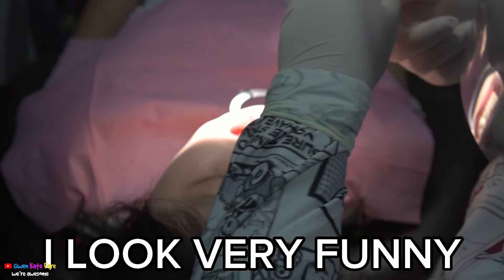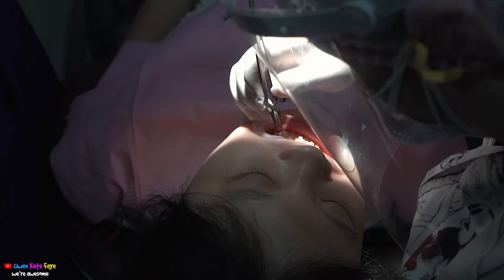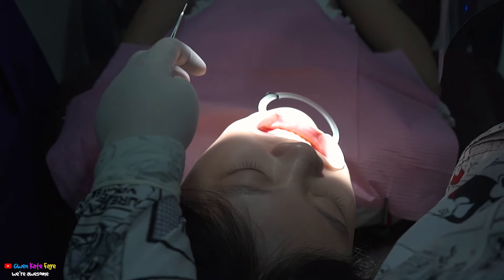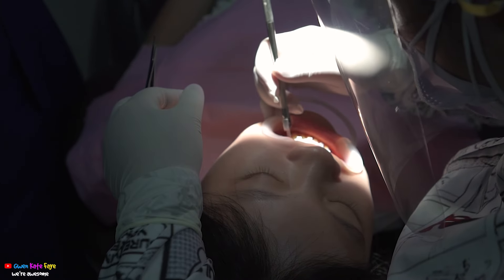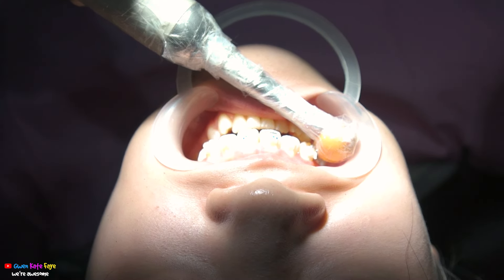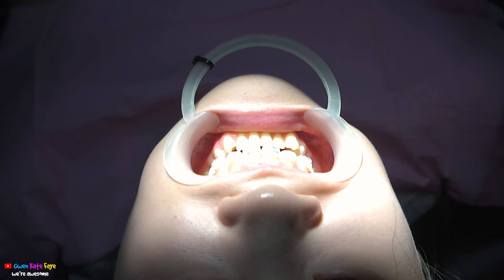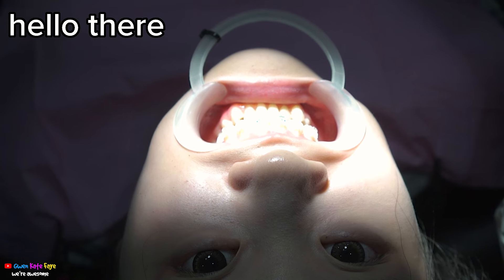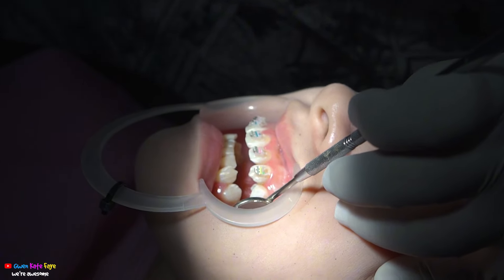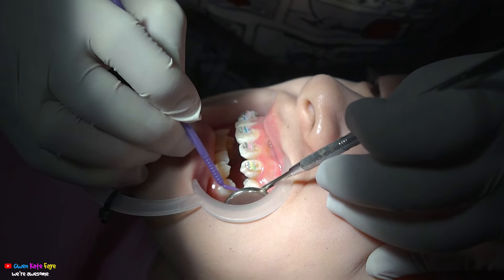Another view of me from the back — I look very funny. A very, very close-up view of my teeth. We're doing the top part of my teeth first and as you can see the braces are looking very nice. It looks like I'm almost done with the top part and I'm very excited to see how it looks.